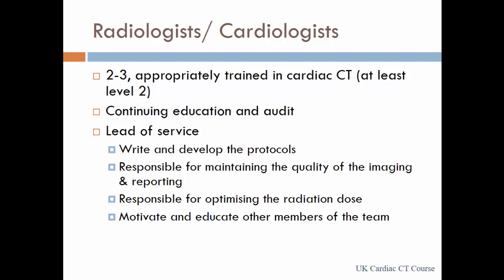It's very important. Whoever is the lead of the service, if you have a lead, then you would be involved in writing up and developing new protocols. You will be responsible for maintaining the image quality, quality of the reporting that you're producing, then optimizing the radiation dose, etc. And you're also responsible for motivating the rest of your colleagues, both among the doctors as well as among the radiographic staff.